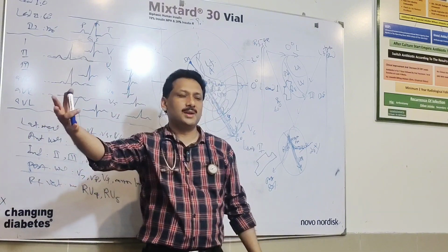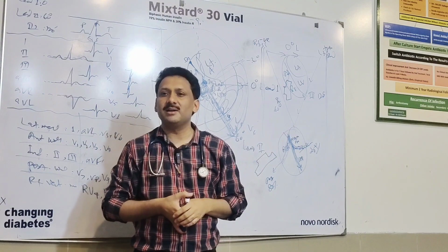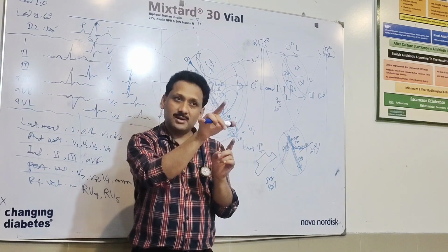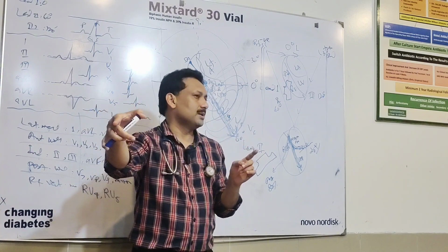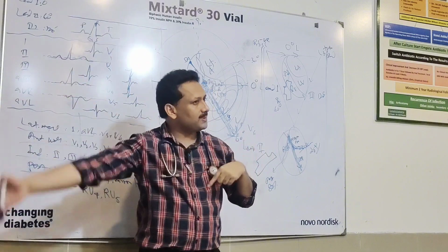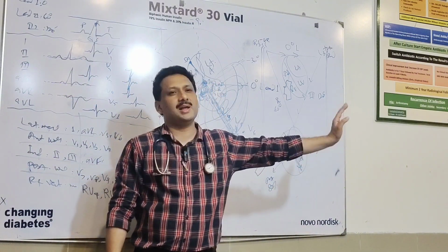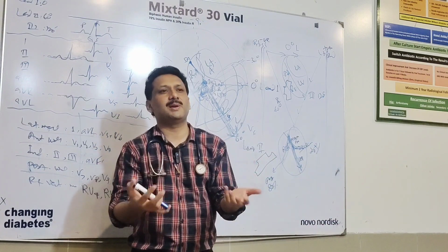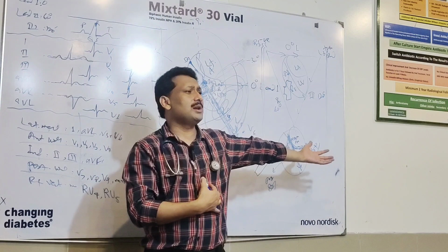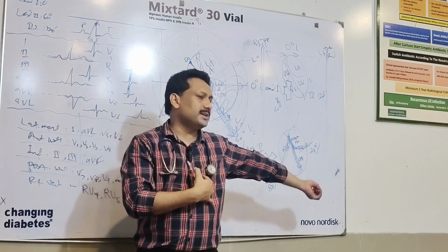Situation number 2, a person is having right ventricular infarction and besides that also having posterior wall infarction. It means right coronary artery dominant. So you speak the word right coronary artery dominant where right coronary is supplying the posterior wall, circ dominant where a person is having circ supplying the posterior wall, and inferior is obviously supplied by the right coronary, and the rest is anterior wall, septal wall. This is supplied by the left anterior descending artery.